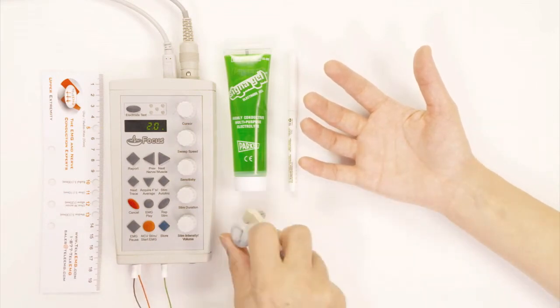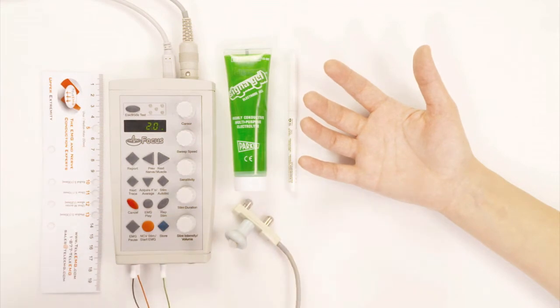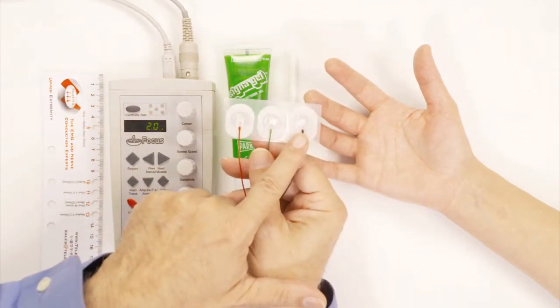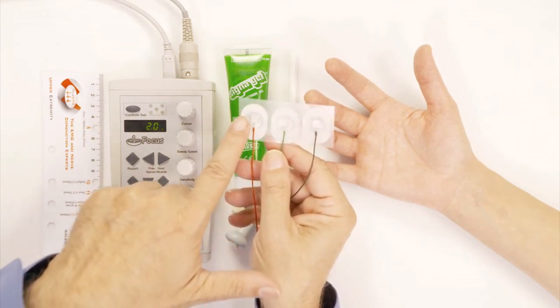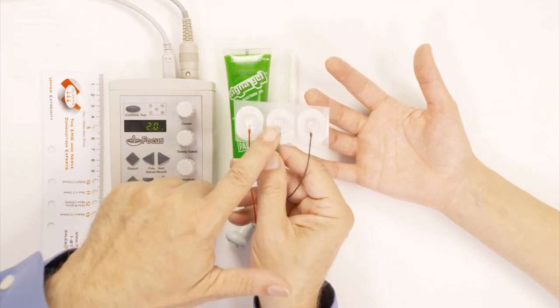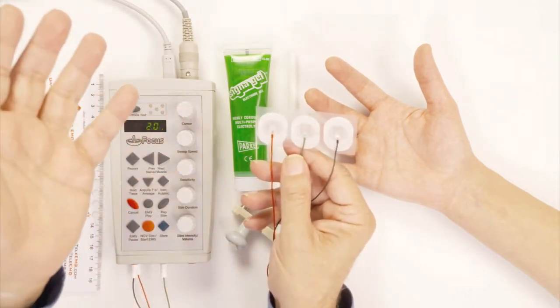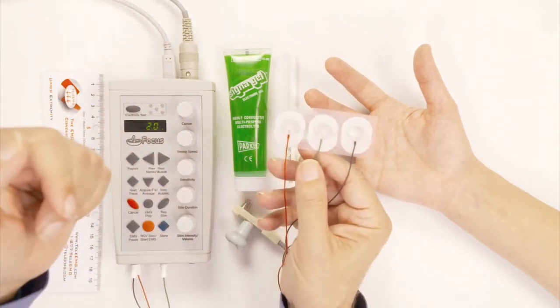And the last thing I want to show you are the electrodes. So there are actually three electrodes. One is the black, which is the active electrode. The second is the red, that's the reference electrode. And the third is the green, that's the ground electrode. And we put all three electrodes in all the studies in nerve conductions that you're going to see.